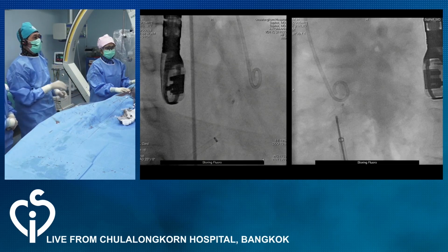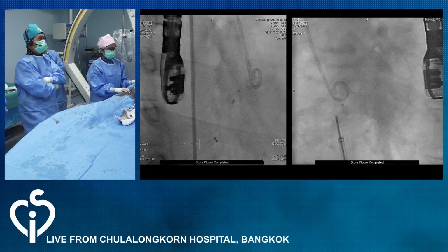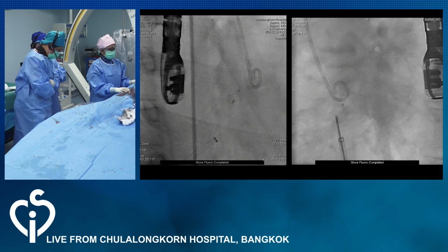Okay, so that's nicely released. And we check the angle again.